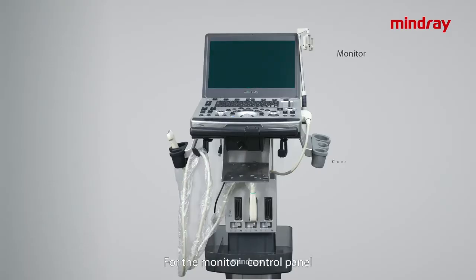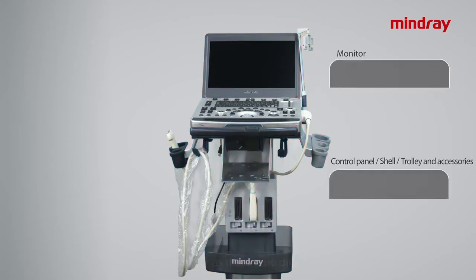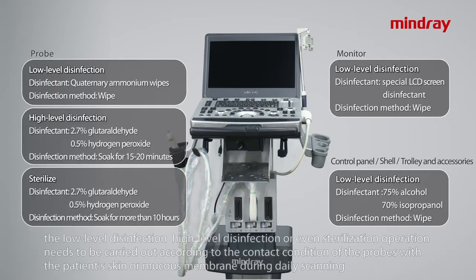For the monitor, control panel, the shell of the main unit, the trolley and accessories, low-level disinfection is sufficient, as there is no direct contact with patients. For the probes, the low-level disinfection, high-level disinfection, or even sterilized operation needs to be carried out according to the contact condition of the probes with the patient's skin or mucous membrane during daily scanning.